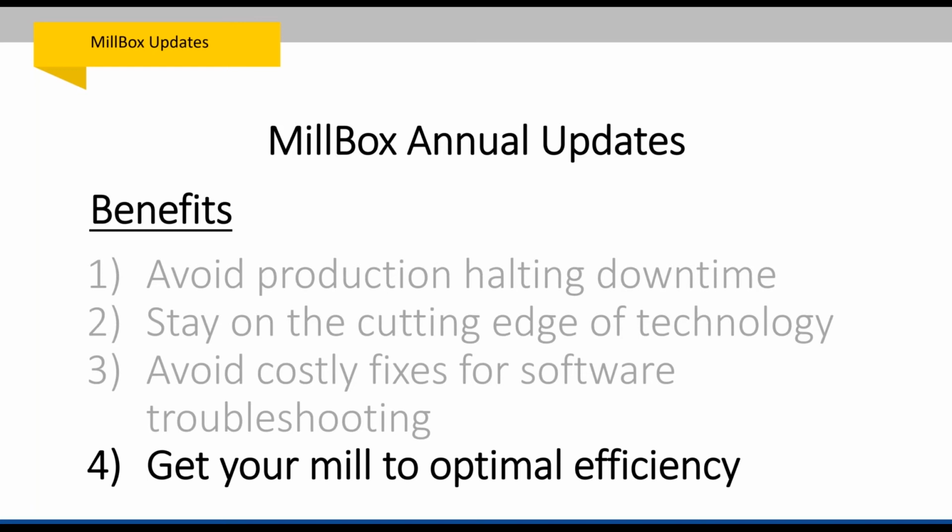We can tweak your strategy. Of course, Zahn can tweak your strategy, and they can walk you through that at Zahn support. But by and large, we share the strategy improvements that we've learned about, and certainly we share the bug fixes and all the patch updates and all the new features. And to take advantage of all that, you need to be on the newest software. So get current on your annual updates. Those are the 4 benefits, all right?